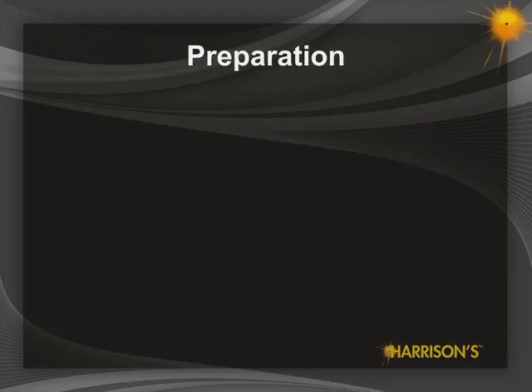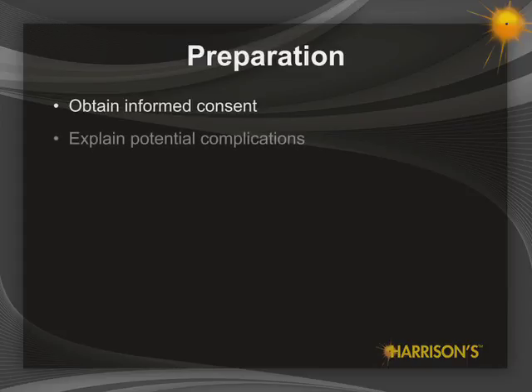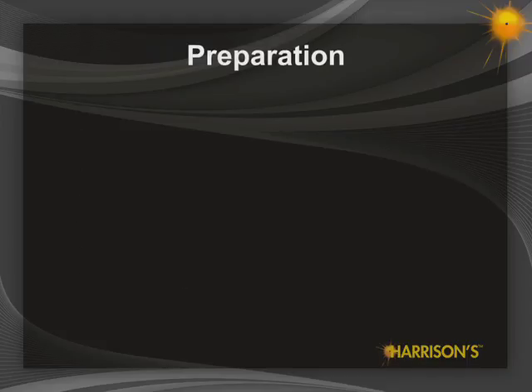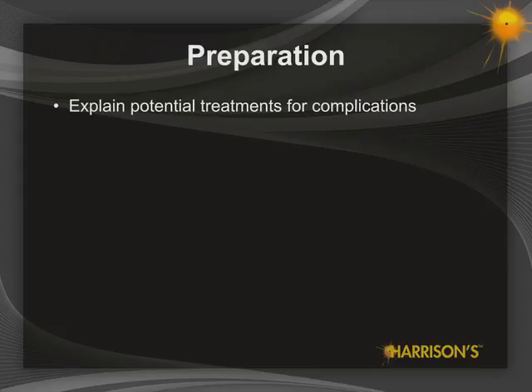In preparing for the procedure, obtain an informed consent from the patient. Explain the potential risks of the procedure, including infection, bleeding, headache, backache, and nerve injury. Explain potential treatments for these complications.